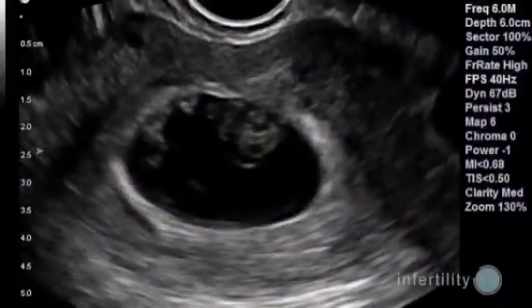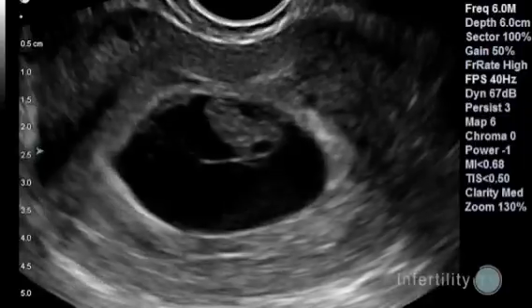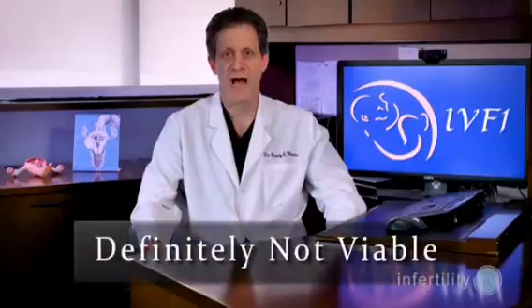The last thing that becomes visible are the pulsations of a couple of tubes, which will eventually become the heart. For simplicity, we just call this the fetal heartbeat, but these tubes don't actually form into a heart for several more weeks. We can divide ultrasound findings in early pregnancy into those that are suspicious that a miscarriage might occur and those findings that definitely mean that a pregnancy is no longer viable and will miscarry. There are 4 times when we can say a pregnancy is definitely not viable.